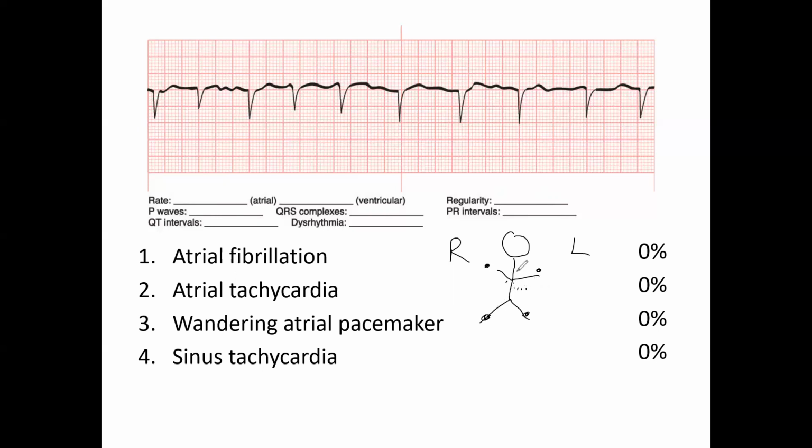And remember, we said that with the heart being oriented kind of this direction, our overall wave of depolarization is going to move for the most part in that direction. So if you have a positive electrode, and that wave of depolarization moves toward the positive electrode, then you're going to get an upright deflection or a positive deflection in your ECG. So your ECG will be right side up.